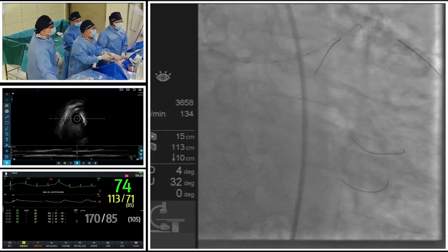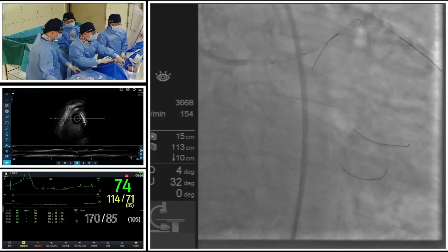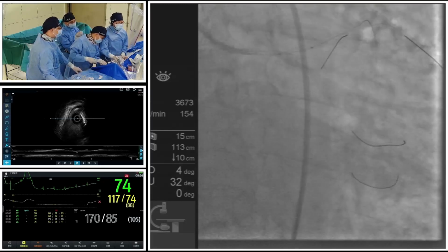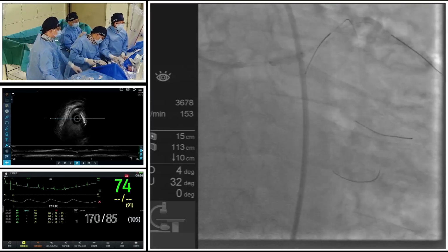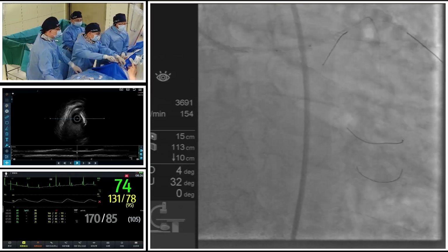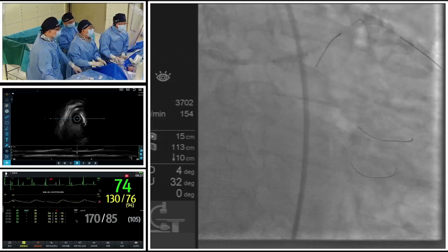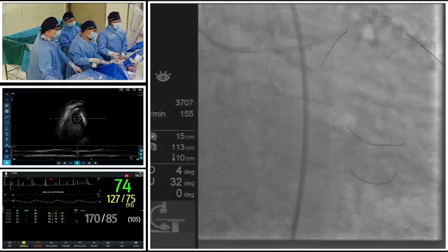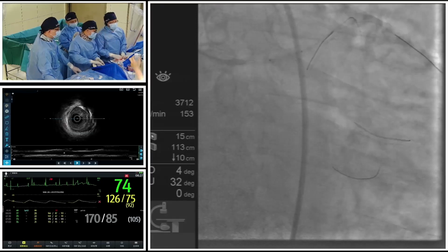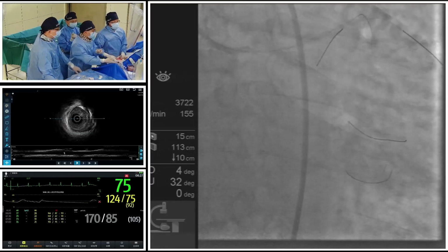We know that if the vessel diameter is over 3.5 millimeter, rotablation system, without the benefit of the wire bias, is less likely to perform debulking techniques for relatively big vessels. However, in this case, we can use lithotripsy for left main bifurcations. So it's suitable for relatively large vessels.